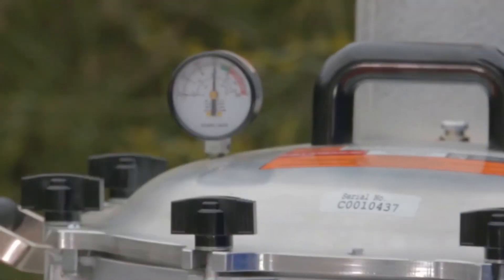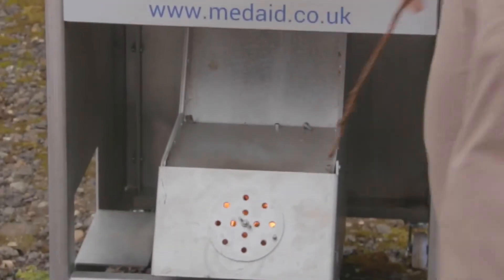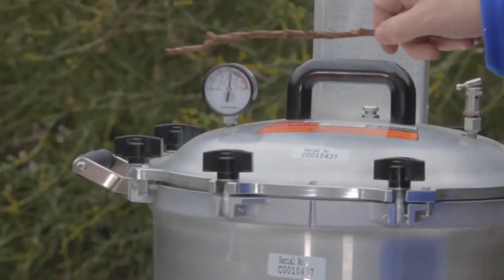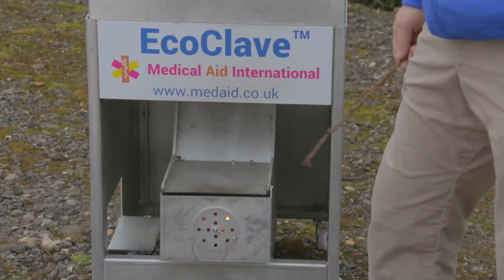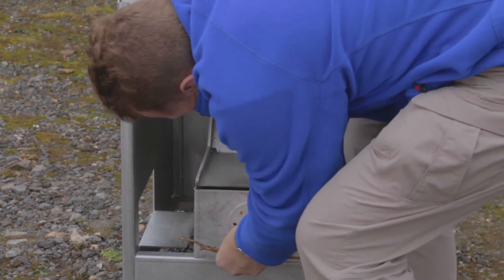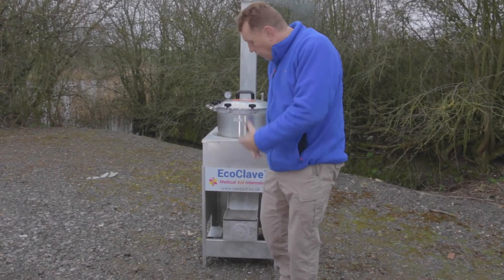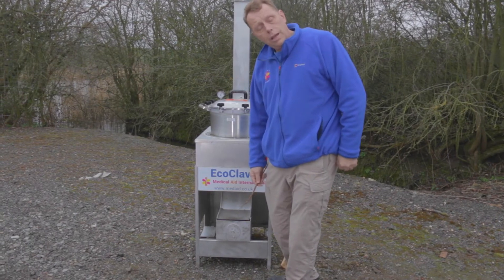The pressure gauge has gone up and it's nearly in the green zone where sterilisation is starting to take place. Because the EcoClave holds in the heat, I'm now going to shut the flap in order to reduce the amount of heat going through. This should lessen the heat input into the autoclave and keep the temperature in the green zone. The flap has holes in it and a bolt so we can easily adjust it and hold it shut, reducing the air input into the fire pit to control the heat.